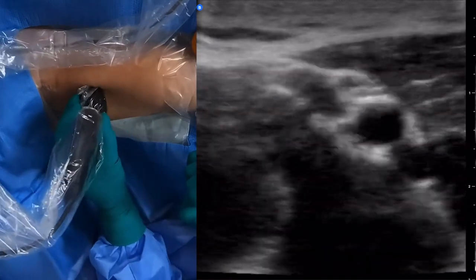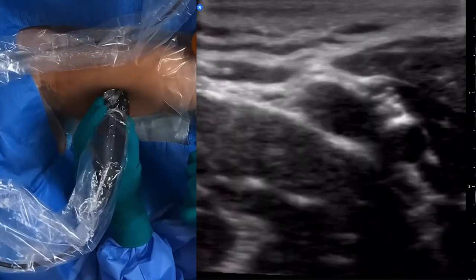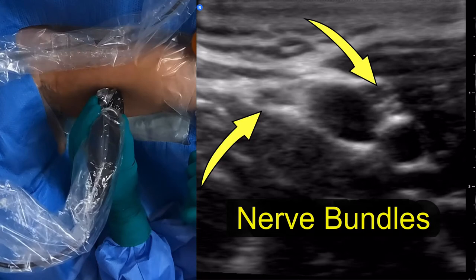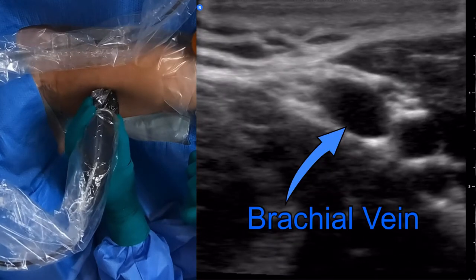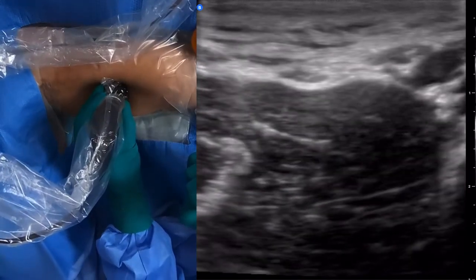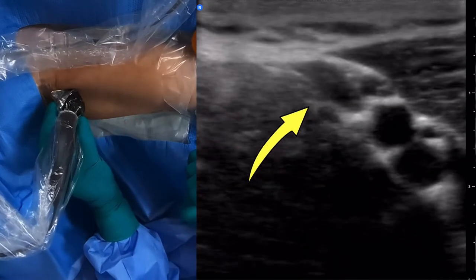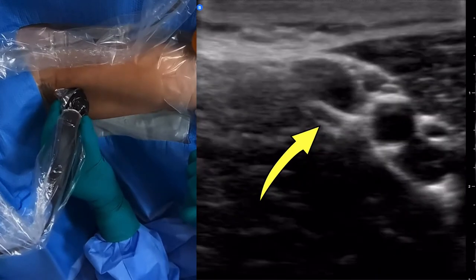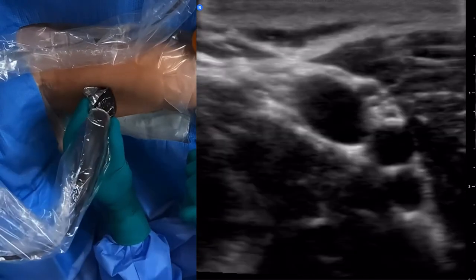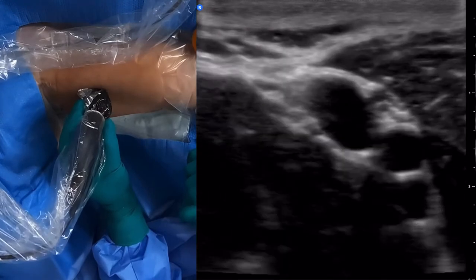You can see two nerve bundles right here — left and right of the brachial vein. That's my brachial artery right there. So he's sandwiched in between two nerve bundles, and it looks like it hides underneath from there. So we'll enter at about here, but we'll start the insertion site at about here.